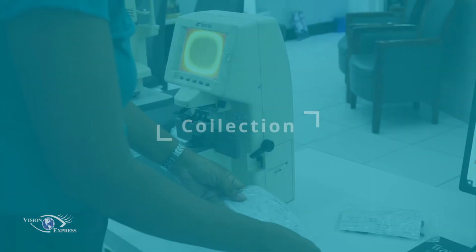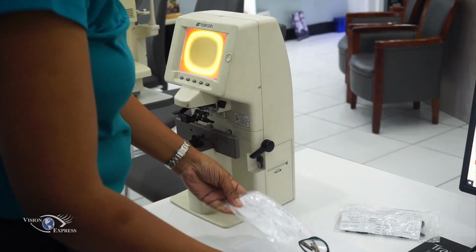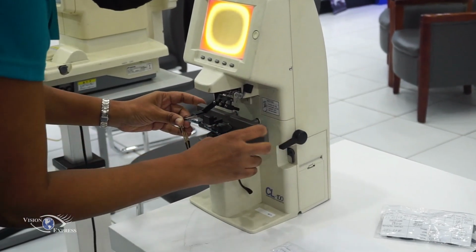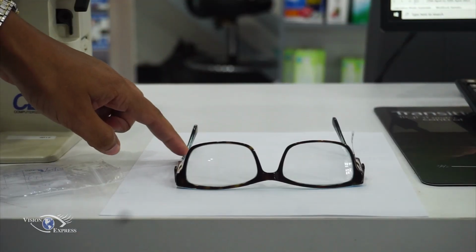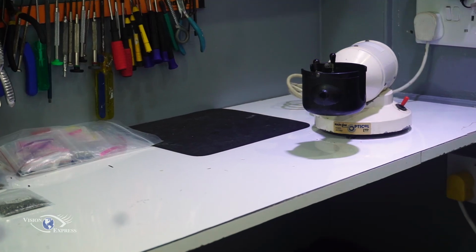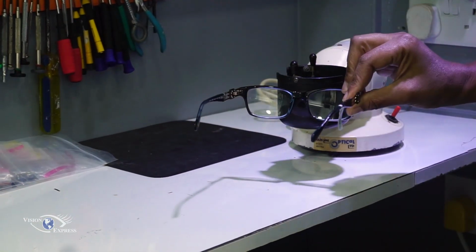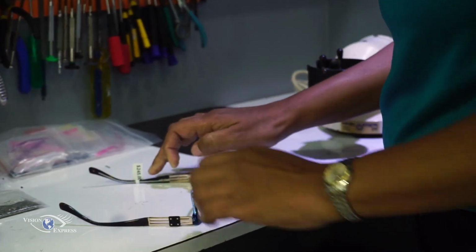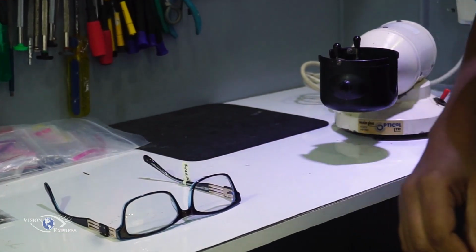Collection. When glasses return from the laboratory, the following steps should be taken. Check for the accuracy of the prescription. Check if the glasses are straight. If they are not, the necessary adjustments should be made. Call patient to let them know their glasses are ready.